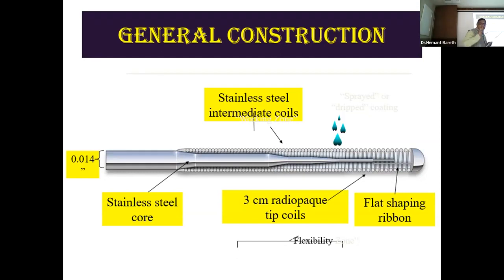Clear? So this is the normal design of a normal guide wire. Now there are exceptions, there are changes, and we will come to that. But this is the usual construction.